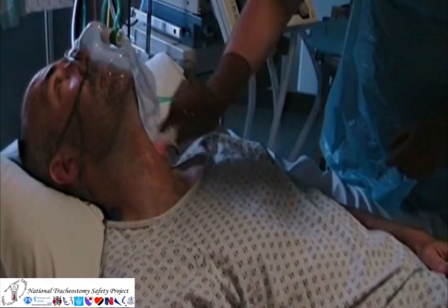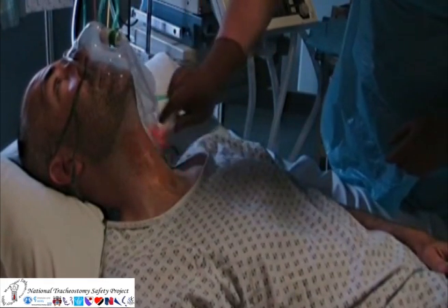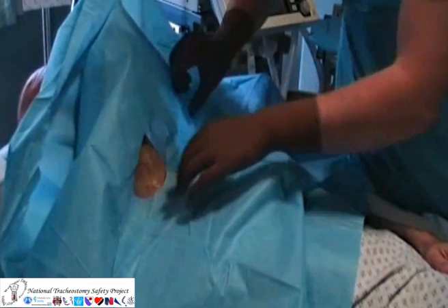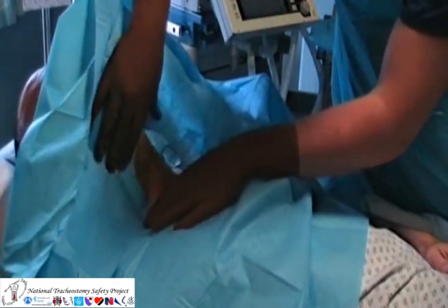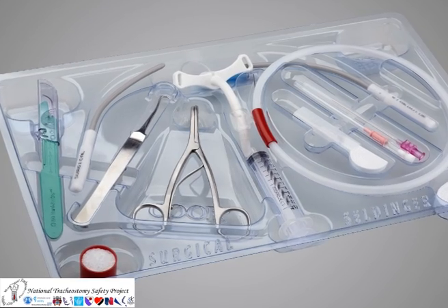If time allows, the anterior neck should be cleaned with an appropriate skin solution and the area prepped as a sterile field. The system used in this video is the MELCA wide bore cannula over needle cricothyroidotomy set.